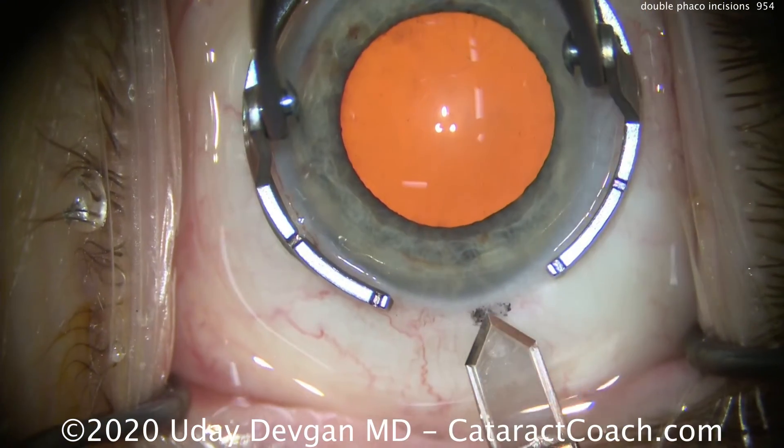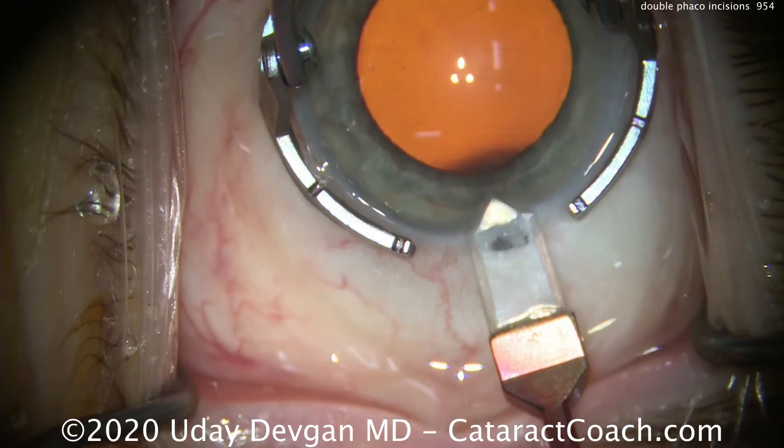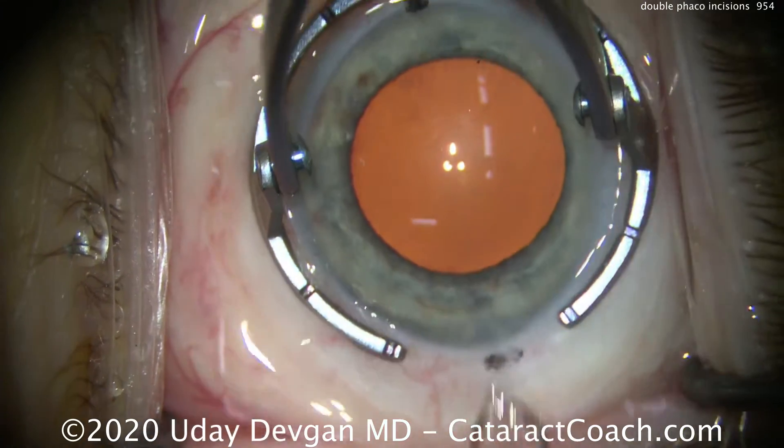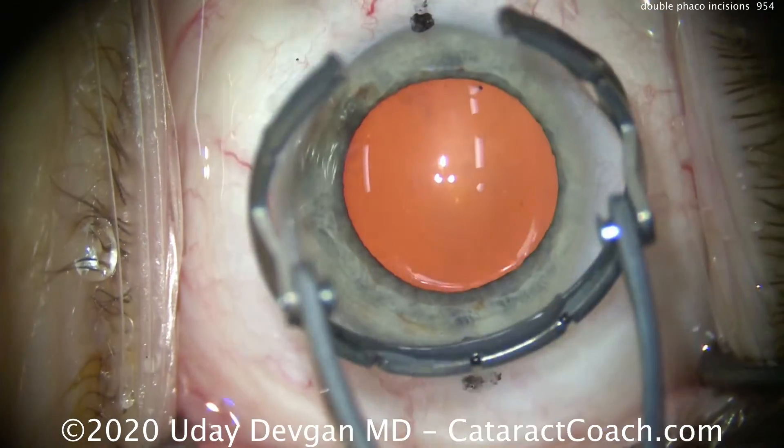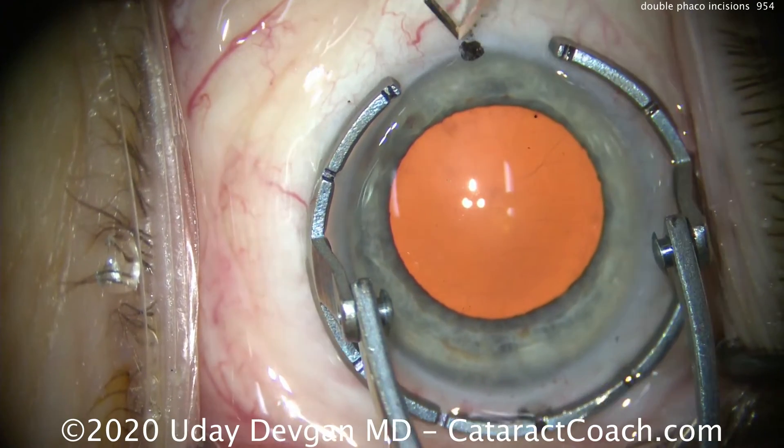Holding the eye with the fixation ring, here's our diamond keratome starting right at the limbal vessels, having a nice consistent tunnel length entering the anterior chamber. This is a 2.75-millimeter incision.